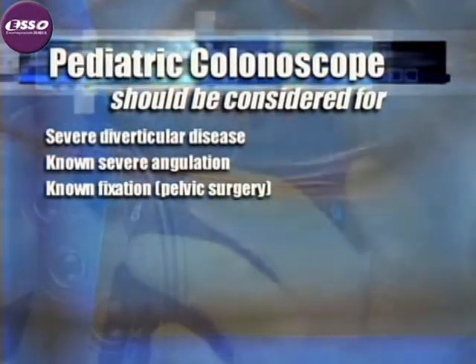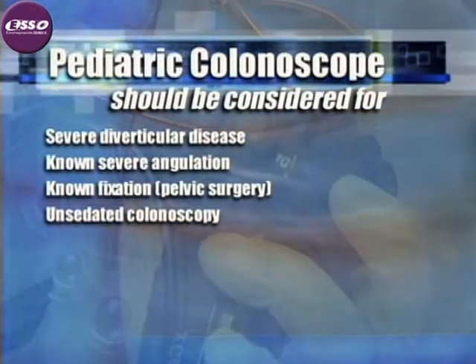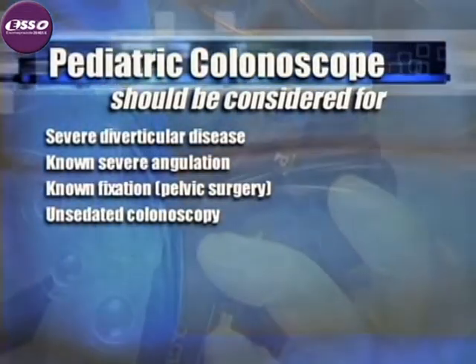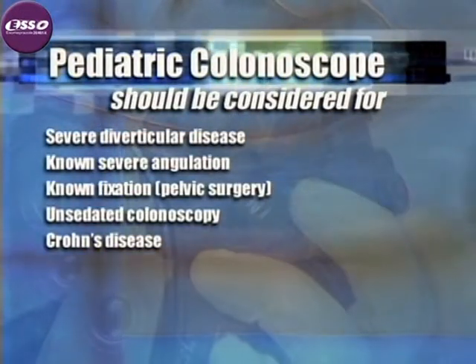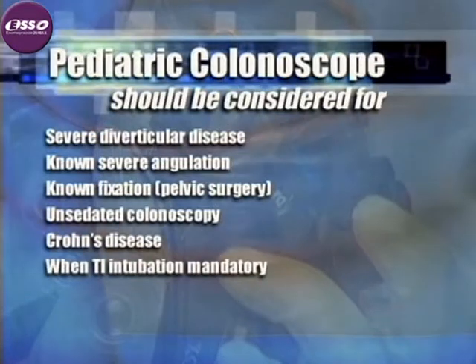The pediatric instrument may be a superior choice when unsedated colonoscopy is considered, particularly in women, because the increased flexibility reduces the pain from colonoscope passage. I prefer the pediatric colonoscope for all cases of Crohn's disease because of the ability to more easily pass strictures and enter the terminal ileum. The pediatric colonoscope is a wise choice when you have to get into the terminal ileum.